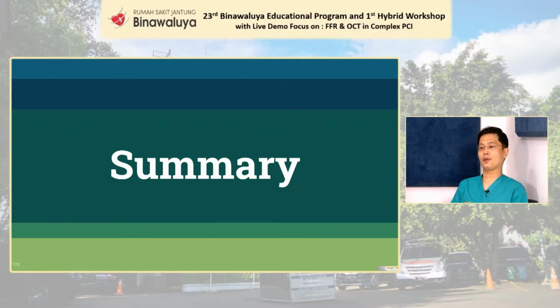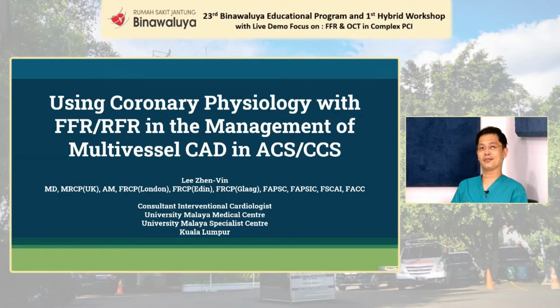So ladies and gentlemen, in summary, I think I've covered a fair bit on the utility of physiology, in particular FFR as well as RFR, being the non-hyperemic pressure ratio. And I think both of these modalities would pair really well with the OCT to improve the overall outcomes of patients. As has been clearly demonstrated in the first case, the overall utility can sometimes be best seen with routine cases. And I don't think we should dichotomize to choose a selected subgroup of patients whereby imaging or physiology should be done. I think it really is best practice to perform them routinely because it has definitively been shown to improve patient outcomes. So thank you very much for your kind attention, ladies and gentlemen.